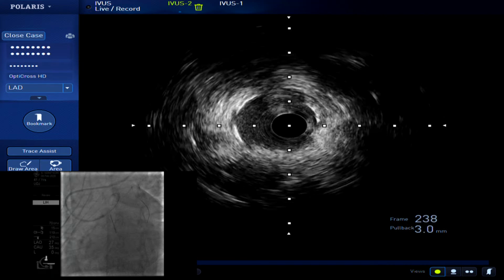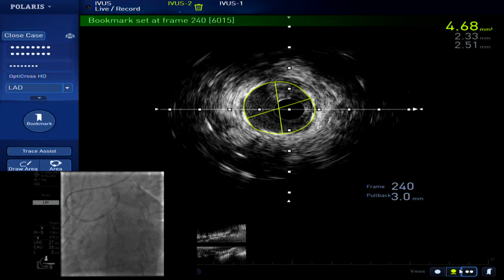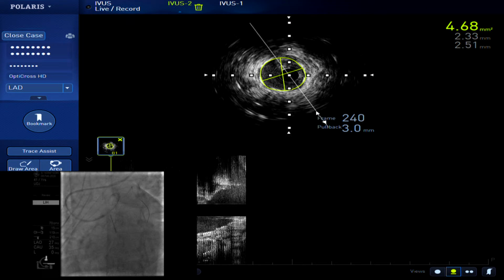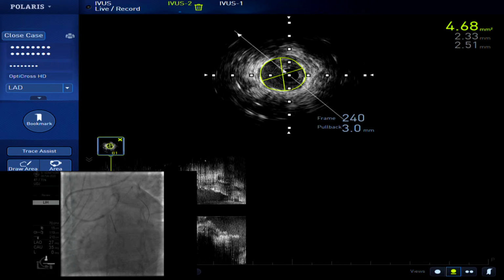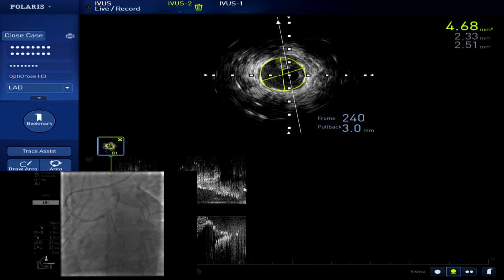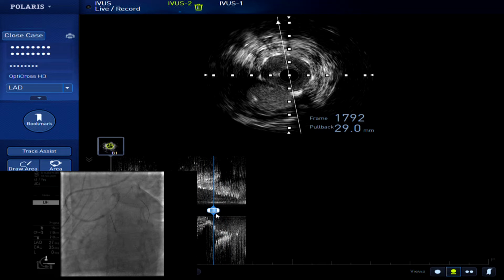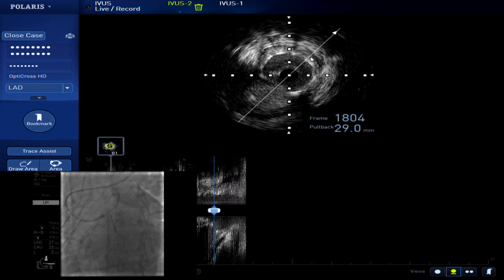So now, do you have any information why the pinch is occurring? We could not see the longitudinal view, but there is no plaque at the diagonal site. Therefore, the main cause of this pinch might be the carina shift. So I think at this moment, if I try to cross the IVUS catheter to the diagonal, there might be some catching of the IVUS catheter by the stent strut. So it might be dangerous.